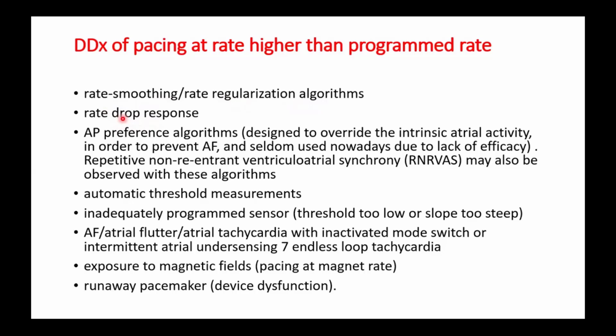When a sudden drop of a certain number of beats occurs, the device paces at a higher rate for an intervention duration, usually pacing in DDD mode at a rate of 100 for 2 minutes.